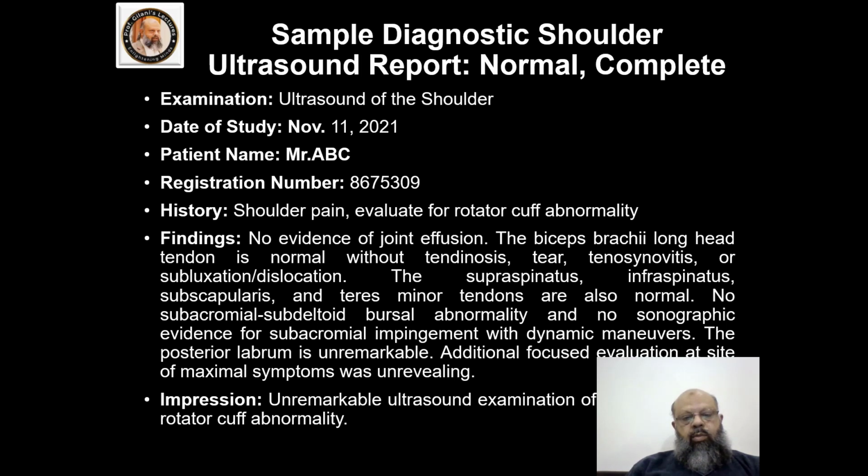We have to mention their appearance and any tear or calcification. If there is any calcification, the size of the calcified area. If there is a tear, we have to give the classification according to the size and location. Then the next thing is the bursal abnormality, appearance of the wall, any fluid inside. Then by having a dynamic examination, performing abduction at the shoulder joint, we will look for any impingement, and then we look at the posterior aspect of the shoulder for the posterior labrum. If everything is normal, we will give the conclusion that it is a normal rotator cuff musculoskeletal ultrasound, or unremarkable ultrasound examination of the rotator cuff.